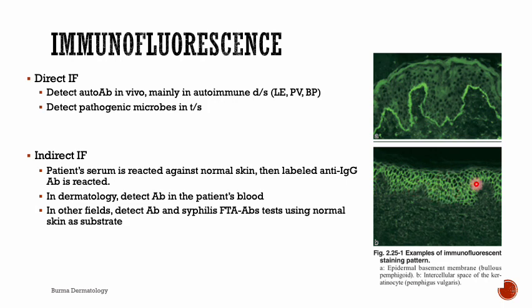We can see the antibody fluorescent pattern in the intercellular space.